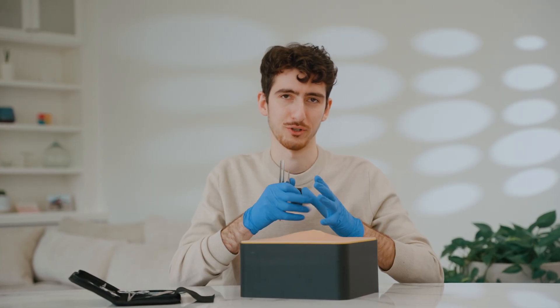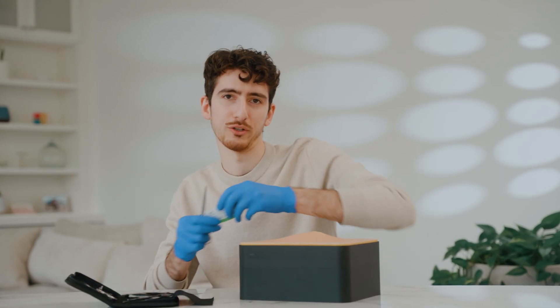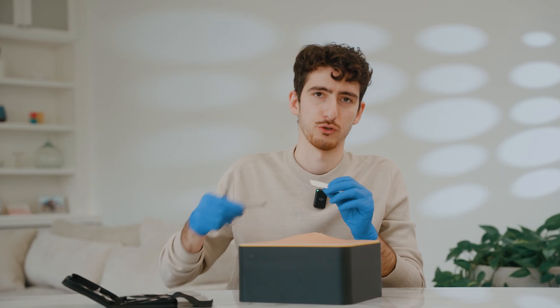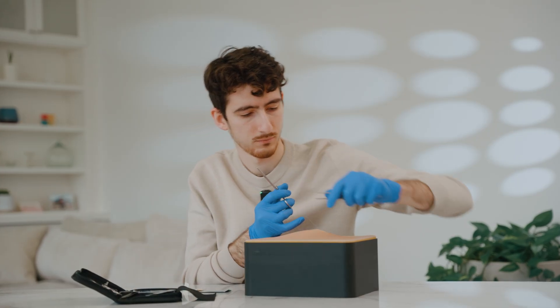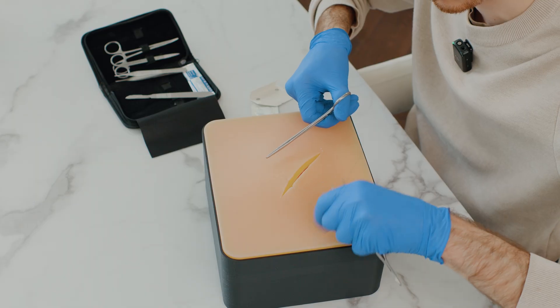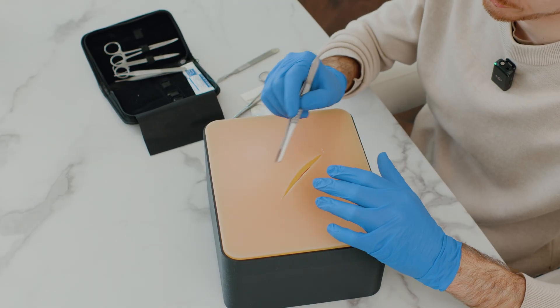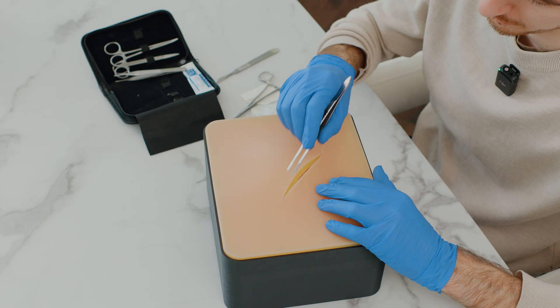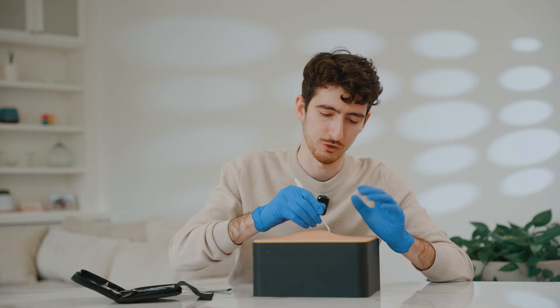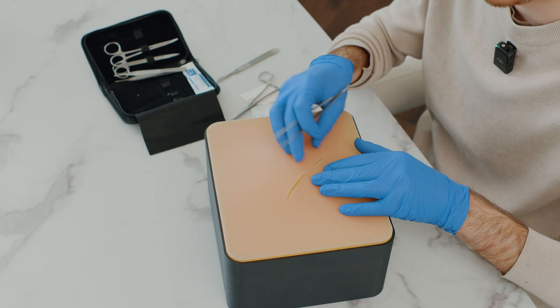When we're done with the incision procedure and the surgery is done, we want to close up the hole. For that we want to grab the needle holders and the suture that you prefer. Once you start doing the suture and closing up the peritoneum, the muscle layer, and all the layers above, you can ensure that the sutures are well placed and slowly close up the whole wound.